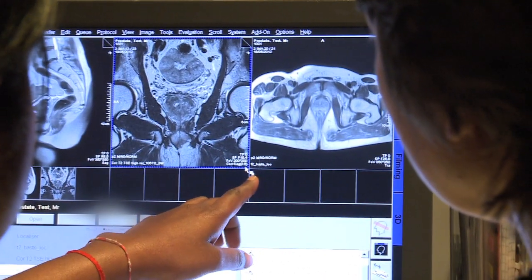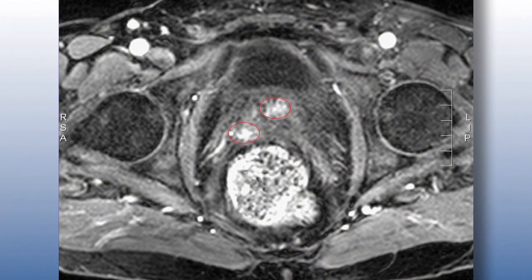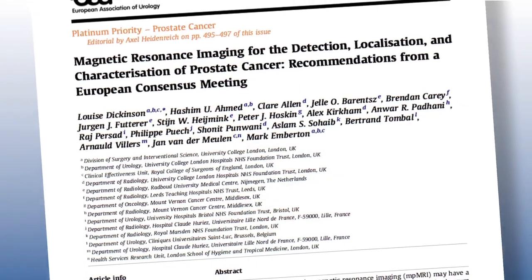If you go back and look in the textbooks from 5 or 6 years ago, many of them say that you cannot see small prostate cancers, and of course that's all now completely erroneous, as shown by the new sophisticated MR imaging. If you can see it on MRI, it's at least 5 millimeters across, usually. That means it exceeds 0.2 cc's in volume, which may be a threshold for clinical significance. It's a very conservative threshold, but it may be a threshold. And therefore you would identify those men with clinically significant disease who would otherwise be missed if they're exposed to TRUS biopsy.